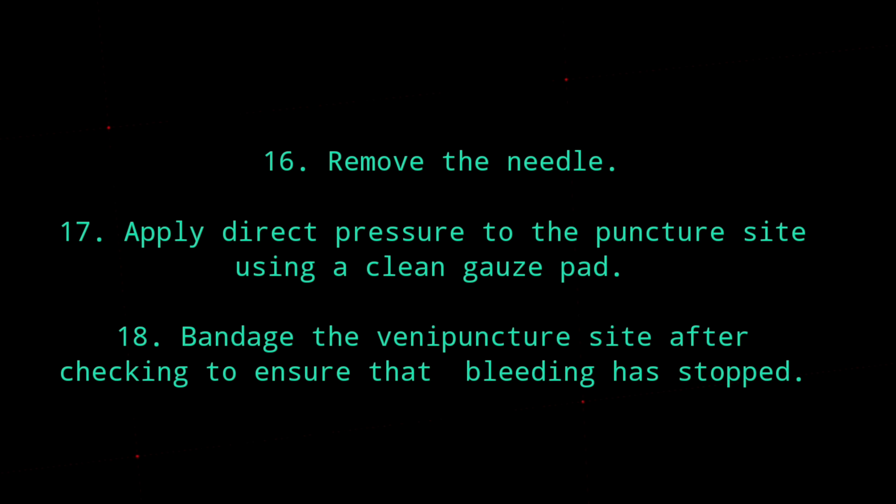So, remove the needle. Then, that's the time that we will apply direct pressure to the puncture site using a clean gauze pad. Then, bandage the venipuncture site after checking to ensure that bleeding has stopped. So, maglalagay ka lang ng bandage kapag ang bleeding ay nag-stop na.